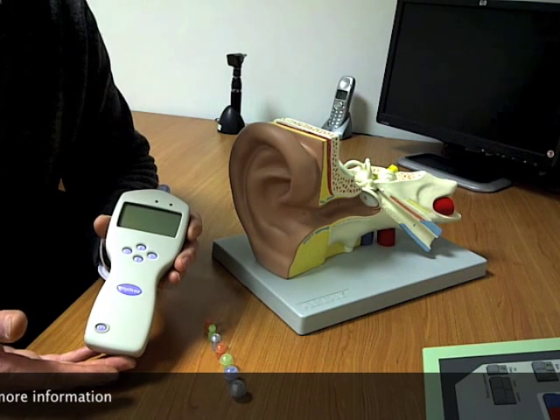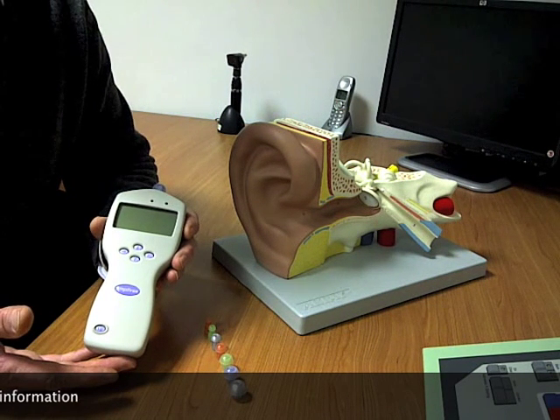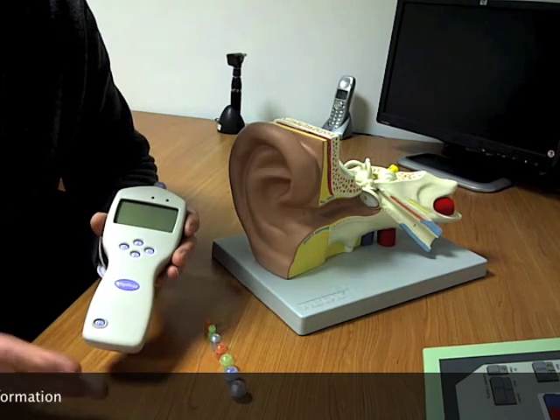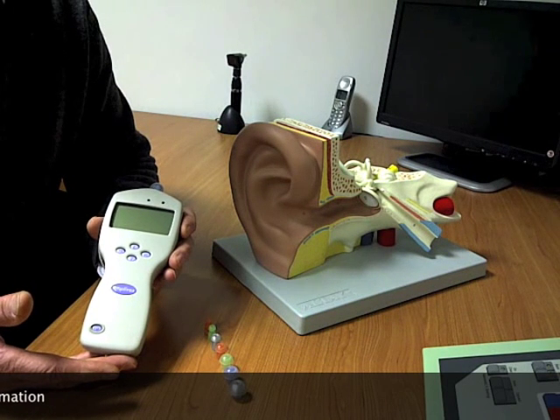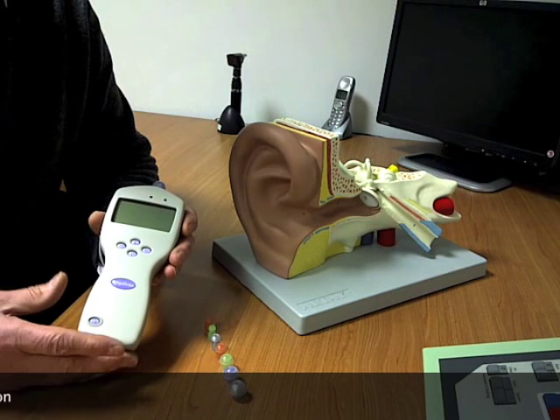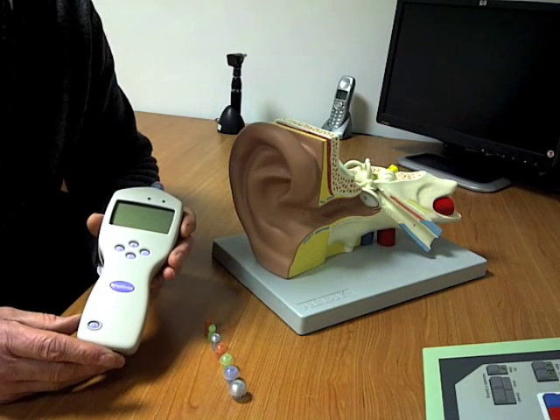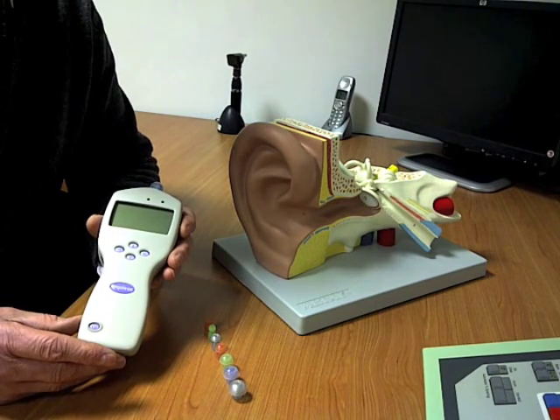Basically it's a very quick, very easy test to do with no discomfort to the client. This will be done from a very early age on children — we would be making these measurements on children from 9 months, for example — no trouble at all. So as an adult, you've got nothing to worry about if the test is considered necessary.